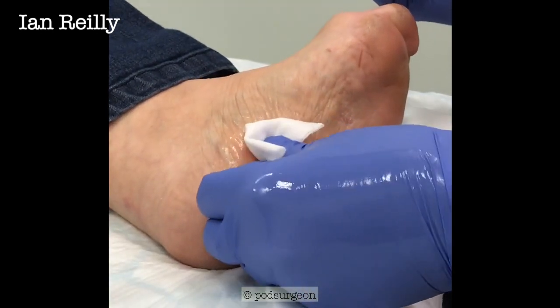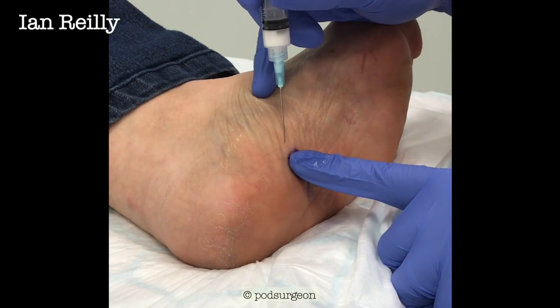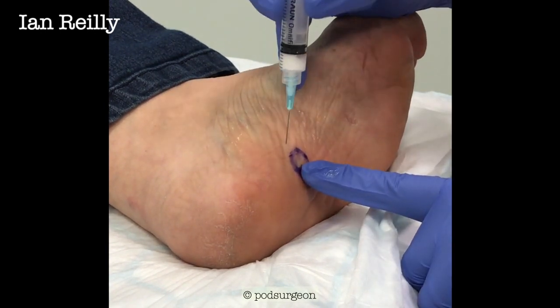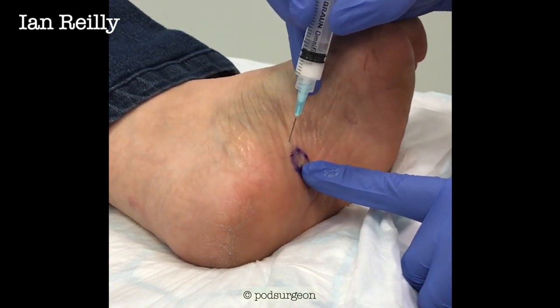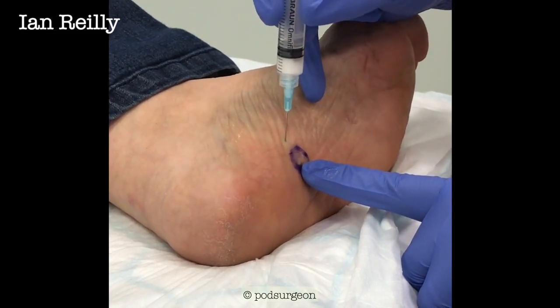Just dry that skin. Right then, little scratch just coming up. Three, two, one, scratch. And then I'm just looking for that little bit of thickness. It's just there, and I can feel that.